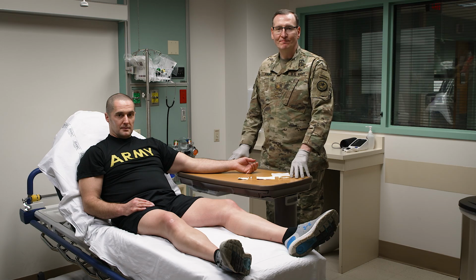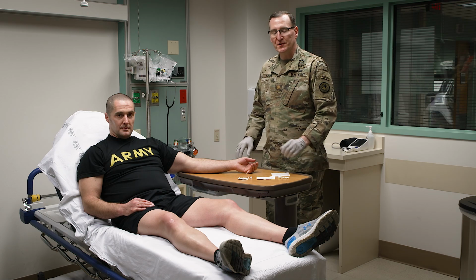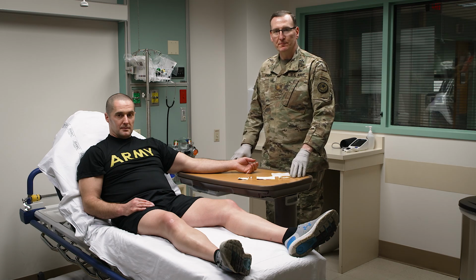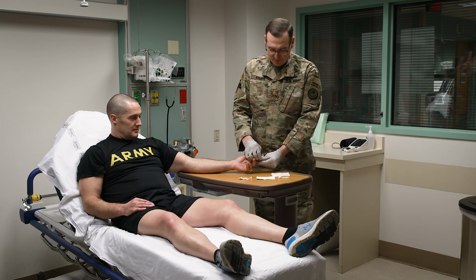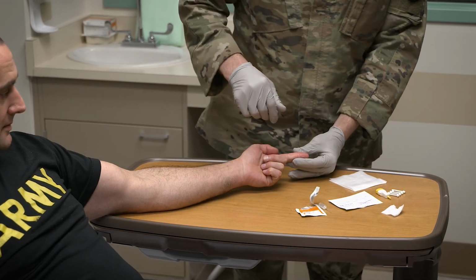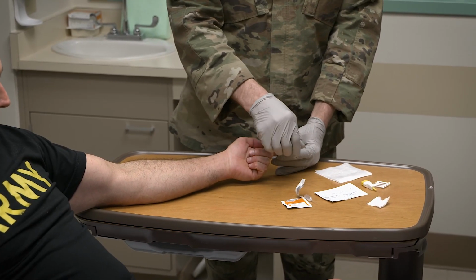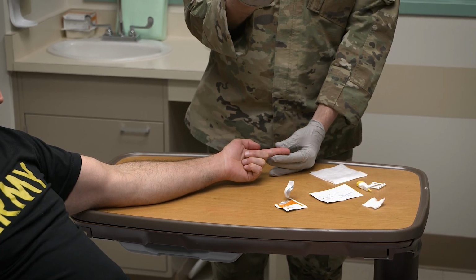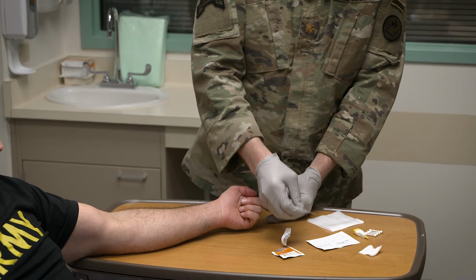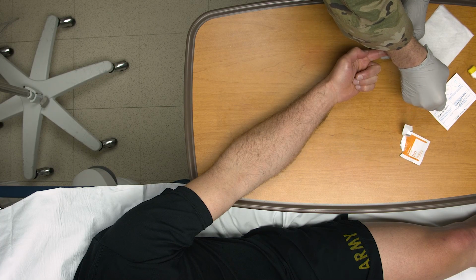Today we're going to go over how to perform an ABO confirmation test using an Eldon card. First thing we're going to do is clean the edge of the finger that you prefer to use. Prior to doing this, please have your patient or donor fill out the ABO card here. Need a little bit of water in your pipette and squirt just a drop of water in each circle.